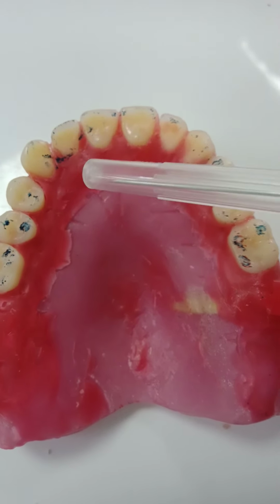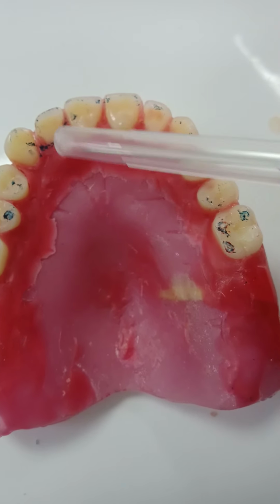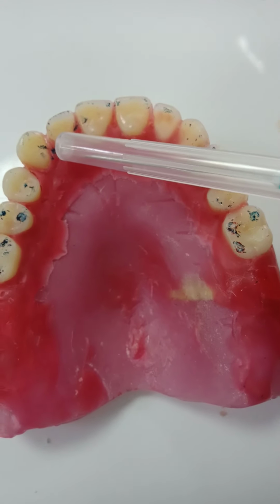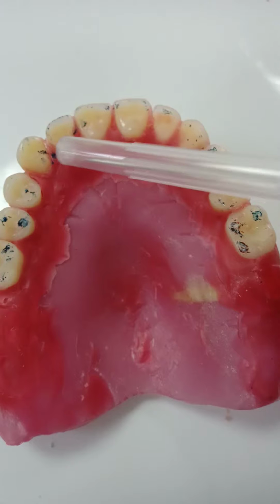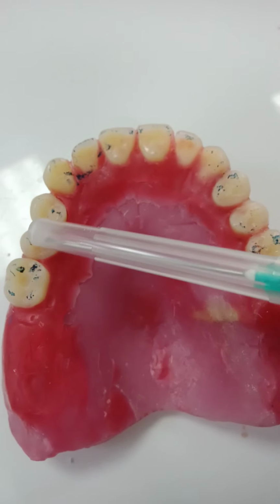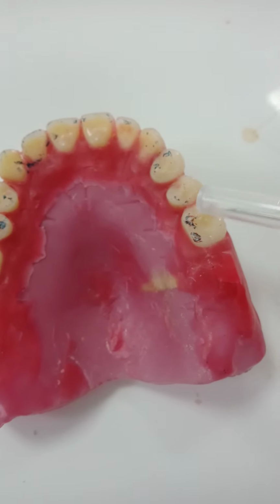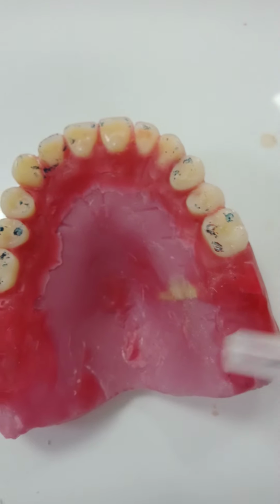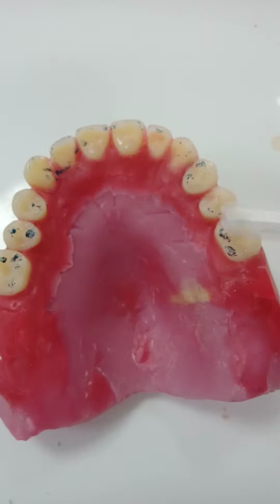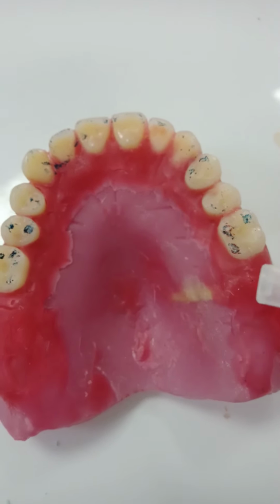So what are we going to do? We're going to reduce the areas of heavy incisal guidance. These are on the wax here, on the wax here, and slightly on the palatal. Just push this tooth less than half a millimeter labially, the gingival part of the tooth. So what are we correcting once more? The non-functional cusp here, the non-functional cusp here, the heavy incisal guidance here, and the non-functional cusp heavy contact here. These are excursive movements. We need balanced movement where we have the colors all together, not heavy on the non-functional cusps. Okay?